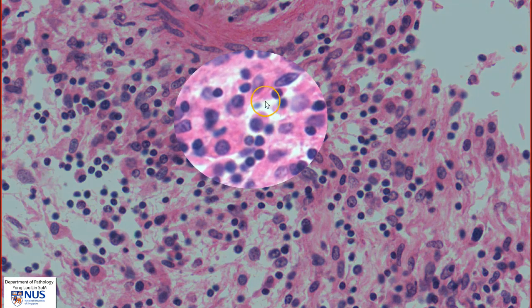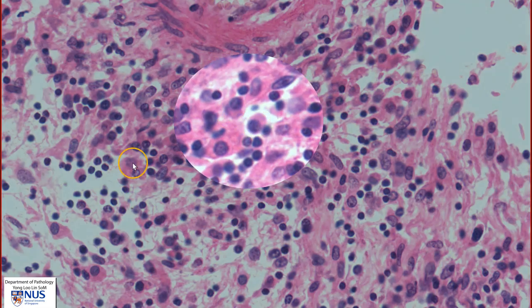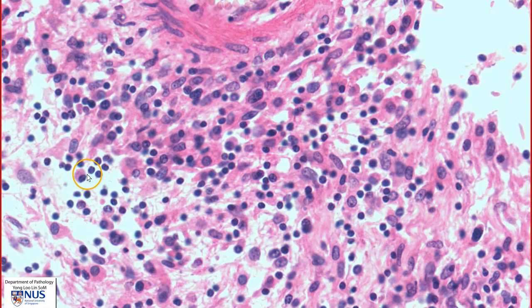Here we can see the plasma cells better, with eccentric round nuclei and a moderate amount of cytoplasm — another plasma cell here, as well as small lymphocytes.